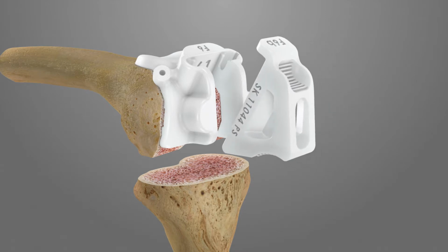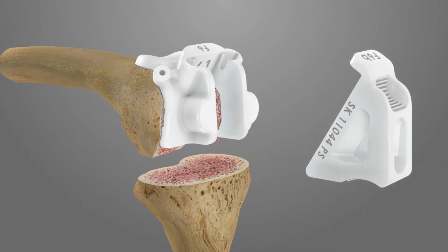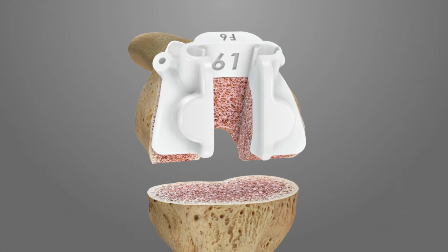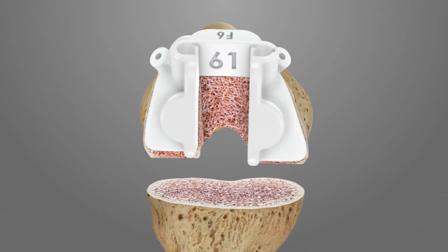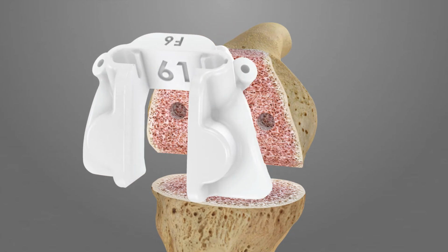Place it in the box of the F6 iJig. If the box gauge does not seat flush with the F6 iJig, remove the F6B iJig and check for any leftover bone or soft tissue that may be preventing the gauge from sitting flush within the F6 iJig. Do not impact the F6B iJig into the F6 iJig.